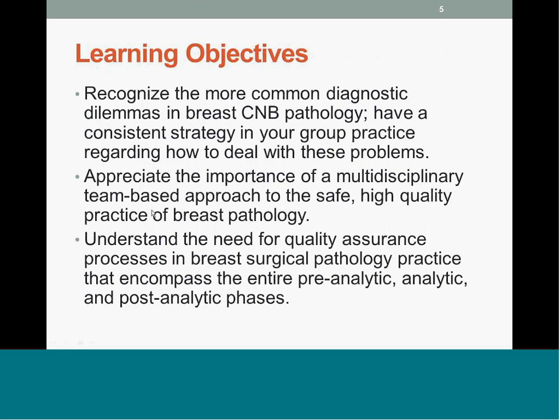My learning objectives for you, the attendees, are threefold. First of all, to recognize the more common diagnostic dilemmas in breast core needle biopsy pathology, and hopefully after this presentation you'll have a consistent strategy that you will develop in your group practices regarding how to deal with these kinds of problems. Secondly, I hope that you will appreciate the importance of a multidisciplinary team-based approach to the safe, high-quality practice of breast pathology. This is really critically important in breast, and we'll talk about that a little bit later. Thirdly, I want to focus a little bit on quality assurance in breast surgical pathology practice and talk about the entire spectrum of quality assurance, including the pre-analytic, analytic, and post-analytic phases, with a specific focus on the importance of second review.